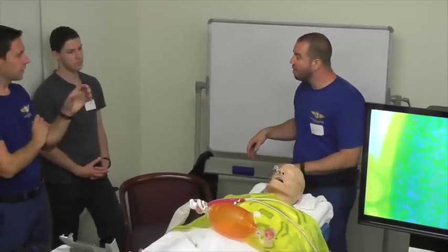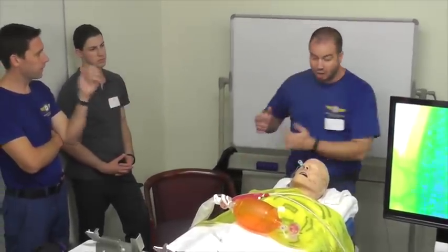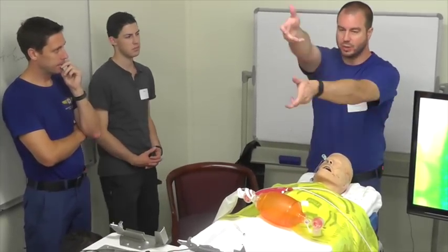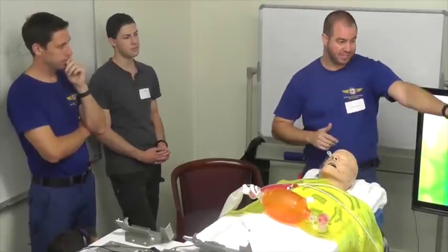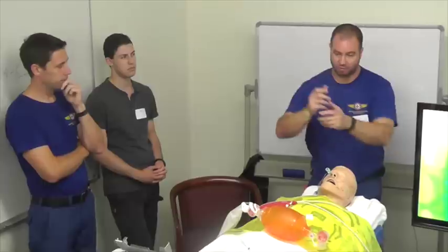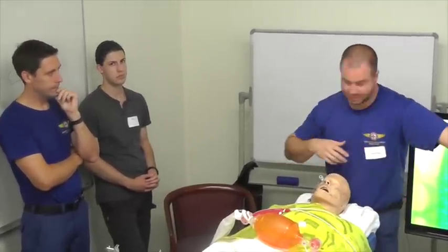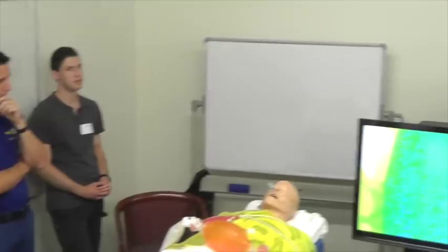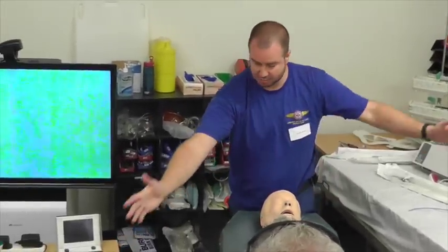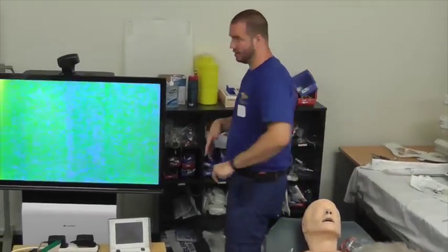Happy? Does the position matter, either from behind or the front? Is that patient specific, or ergonomics? I tend to find that if they're supine, it's often easier to do it in this sort of motion. If they're sitting up, self-selected because of their pathology, it might be easy to do that way. But if you've got very long arms, like big gorilla like me, you can still do it sitting up if you've got it standing on a box, like this, in that sort of motion. But you've got to have the monitor positioned with your drugs ready and your airway assistant positioned appropriately to be able to make the ergonomics easier.